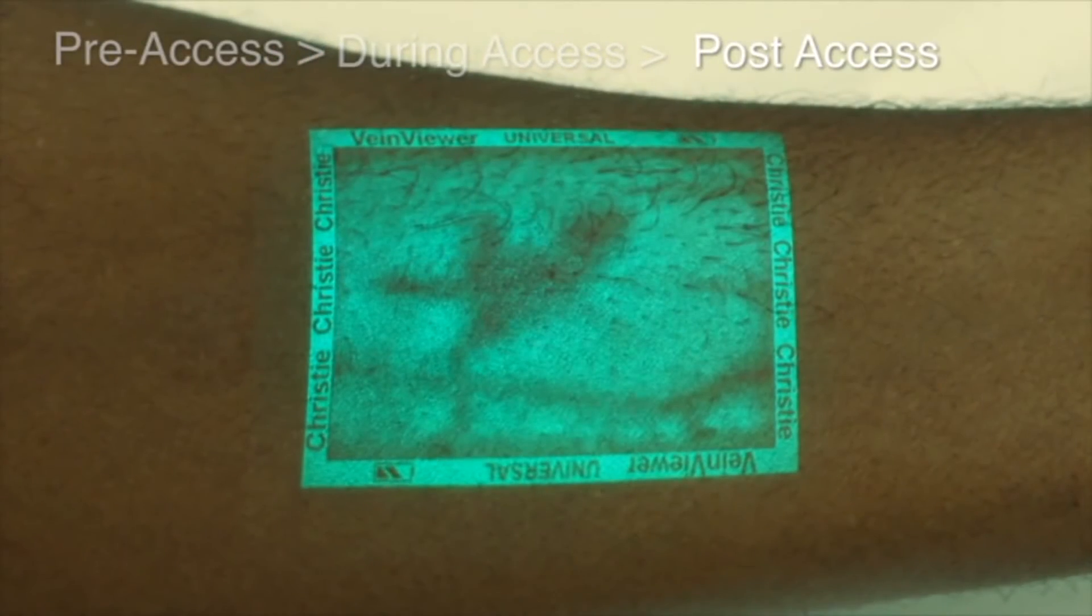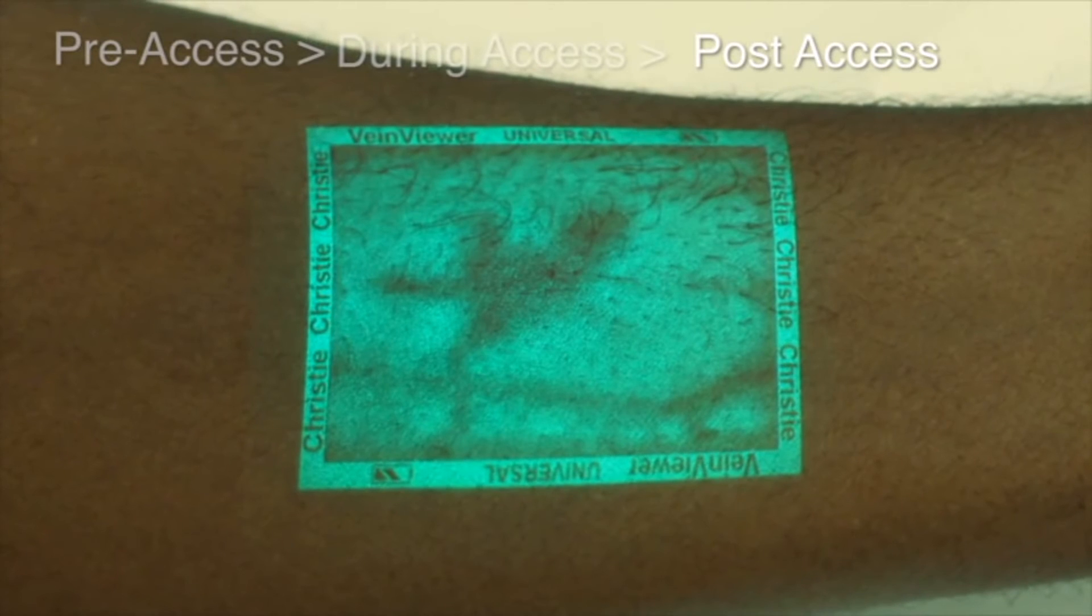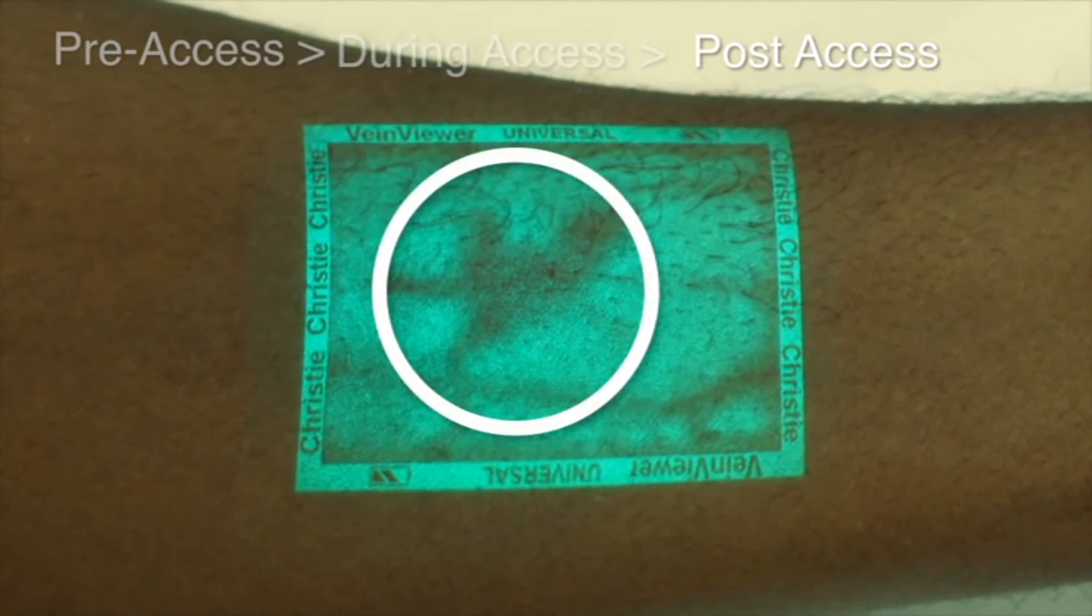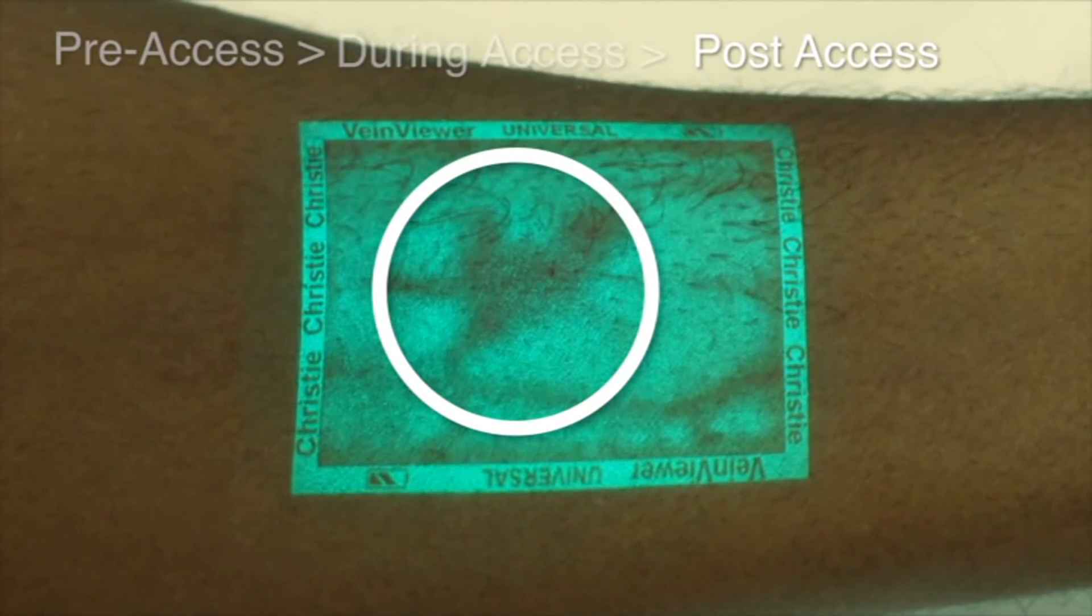Post access, VeinViewer is the only vein illumination device that can help you recognize a hematoma forming from a burst or punctured vessel, giving you the information you need to take action and potentially prevent additional complications.